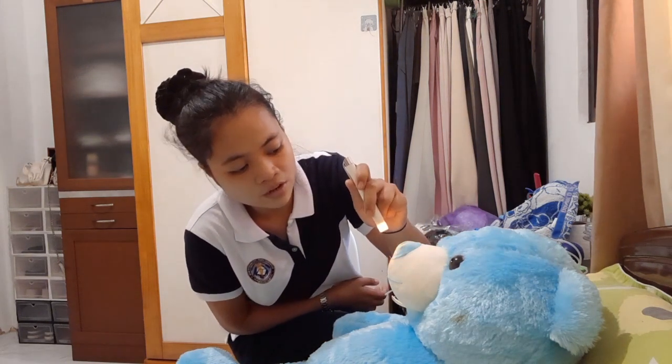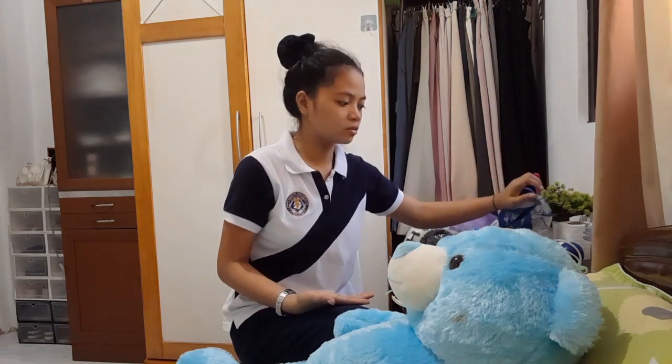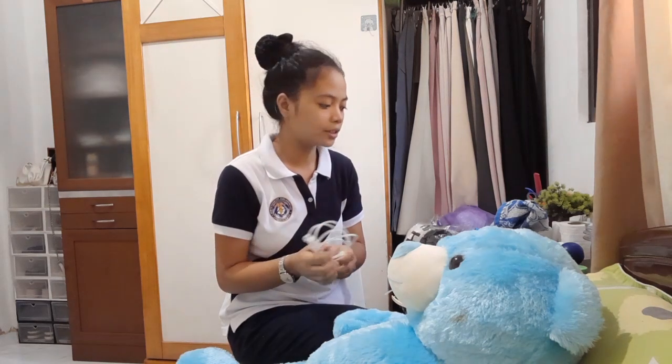of medications. Then next is we're going to assess the client's history of nasal surgery or deviated septum, assess the patency of the nares, the presence of gag reflex, and assess the mental status or ability of the client to coordinate with the procedure. The next is planning. So we're going to determine the size of the tube to be inserted and whether the tube is to be attached to a suction. The next is implementation preparation.